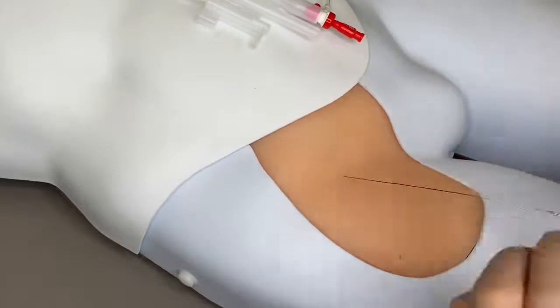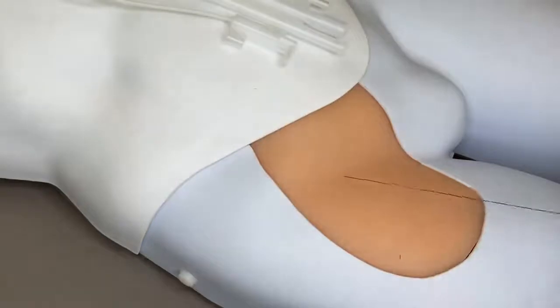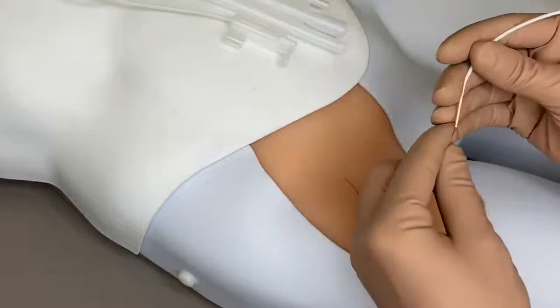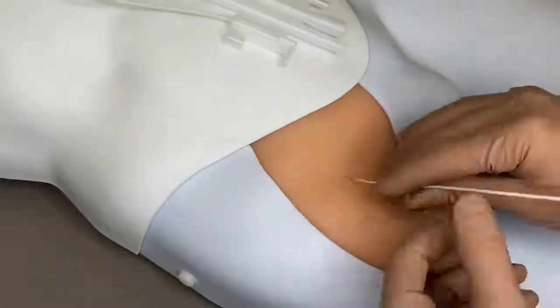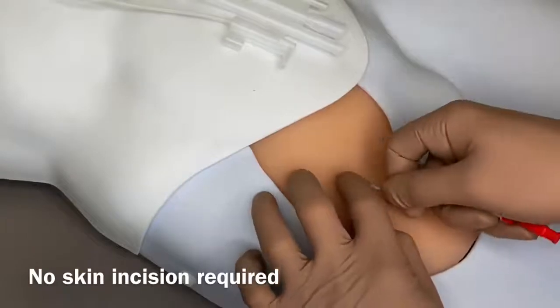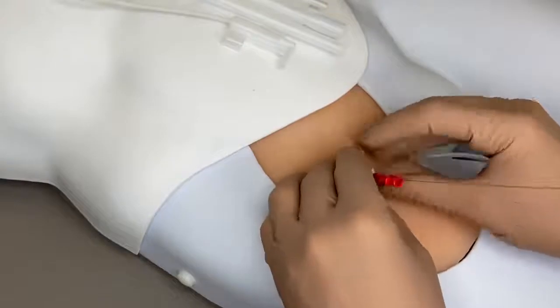Remove the access needle over the guide wire, ensuring it stays in the vessel. Advance the dilator assembly over the guide wire into the vessel. Use a rotating motion if necessary to get the assembly through the skin and soft tissue. Grasp the assembly close to the skin as it is being placed to avoid buckling.